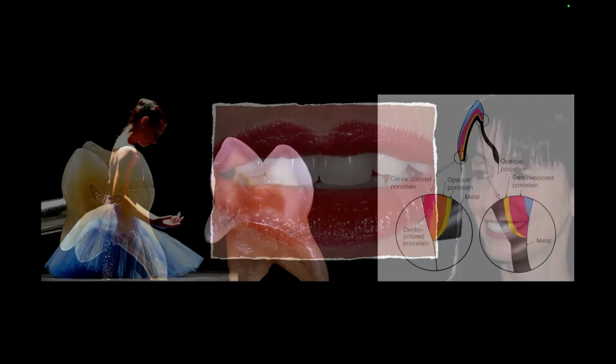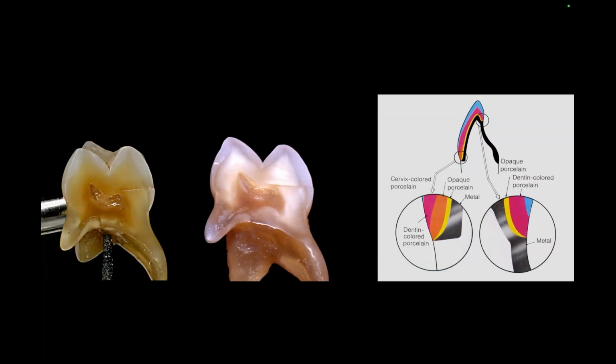When I'm trying to mask things, I think you guys already know that sometimes it's really difficult to do that in the small spaces that we're working in, especially when we have a zirconia or a lithium silicate substructure. I don't have a lot of room to put extra powders on, especially if I'm in monolithic world. I'm more of a layer guy. I do a lot more micro layering than anything else, or full layering, depending on the case. But when you have these really small spaces, it becomes more challenging.